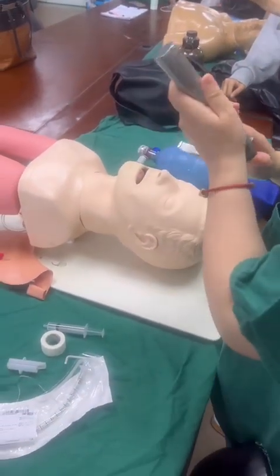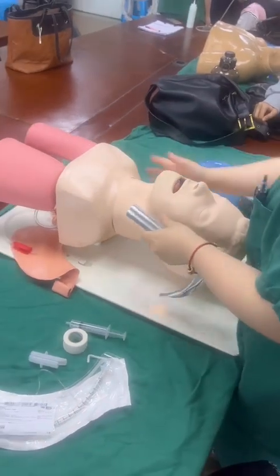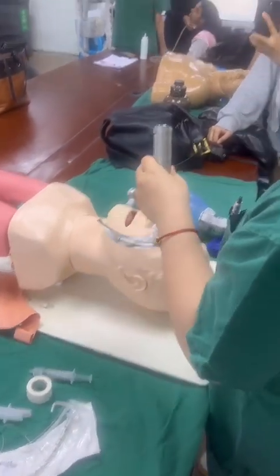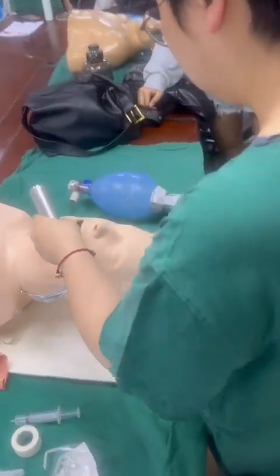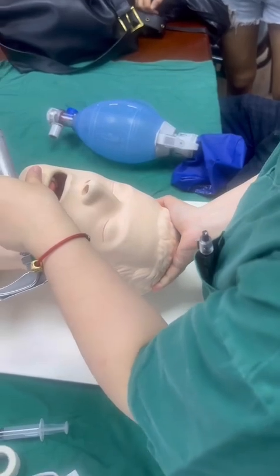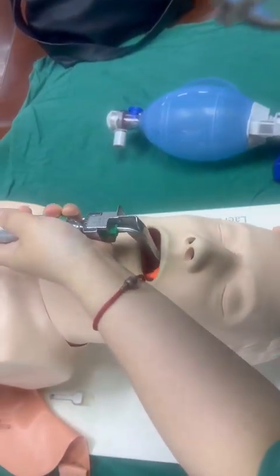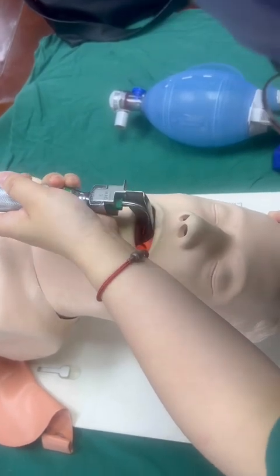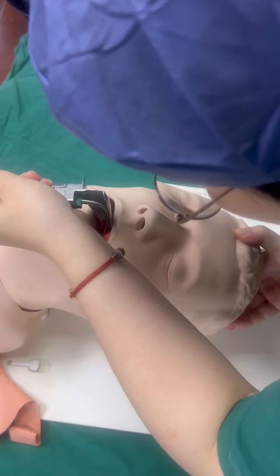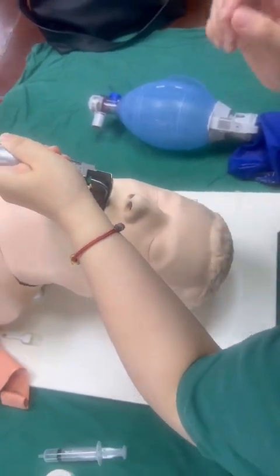Then we hold the laryngoscope with left hand. Put the patient in the supine position. Open the mouth, and insert from the right side of the mouth, and sweep the tongue here to the left. When we see the epiglottis, we insert.